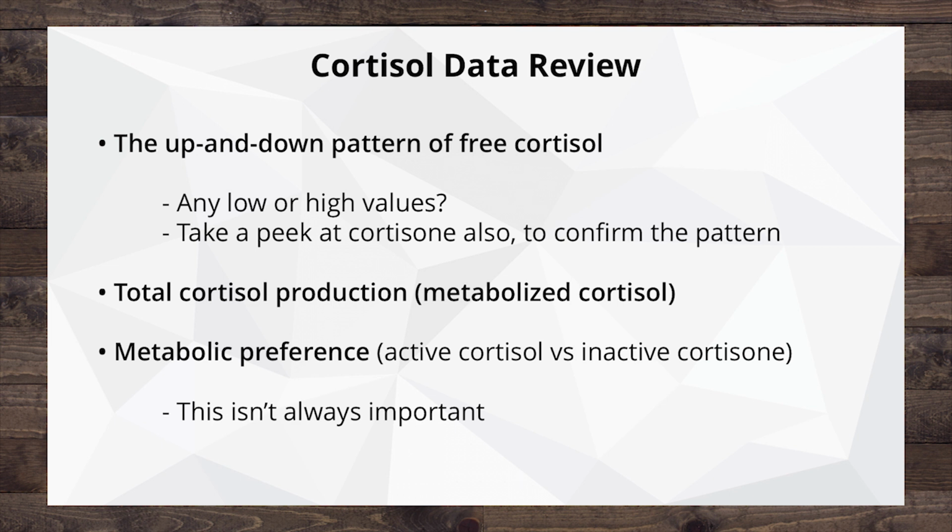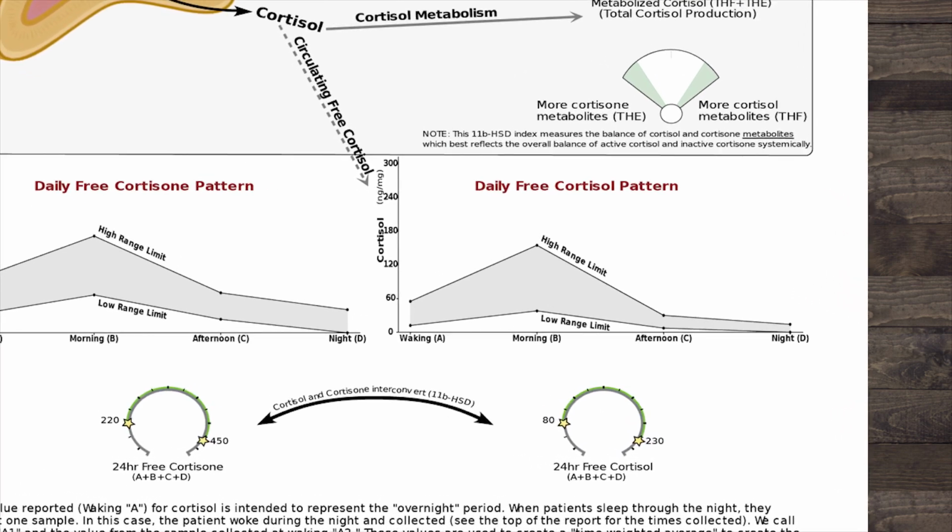So if you want to hang through this first part, we'll understand it at a basic level, and then if you have a more complex set of results, you may want to watch the duration of the video to get a handle on some of these different patterns that you're going to see. So what we're looking at here is the pattern of cortisol, the free cortisol, over time.